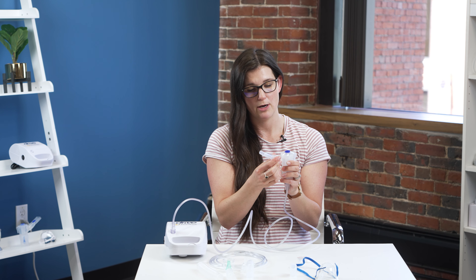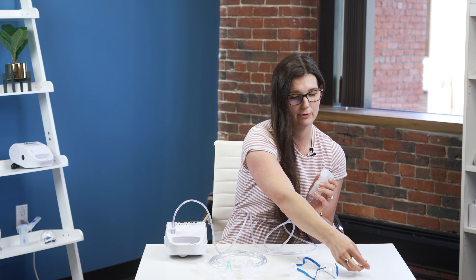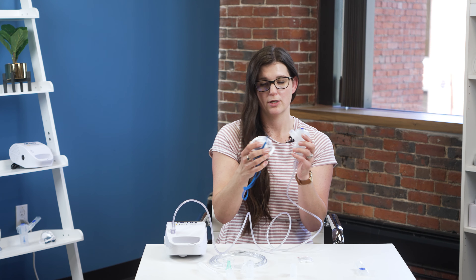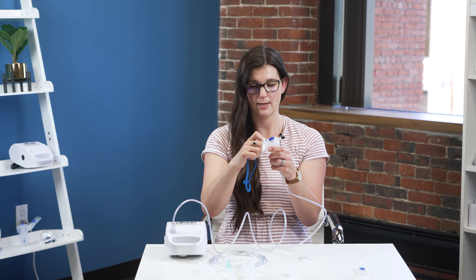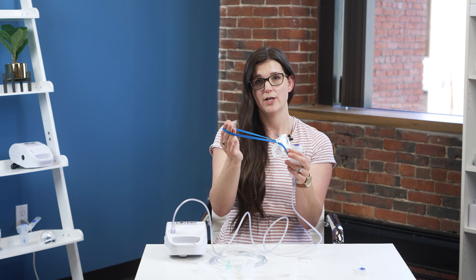Then you have two options. You have the mouthpiece — if you're using the mouthpiece, it just goes right on, and that valve needs to make sure to face up. If you're not going to use a mouthpiece, you also have the option of the pediatric face mask that it comes with, and that just pushes right on and then can go on to the child.